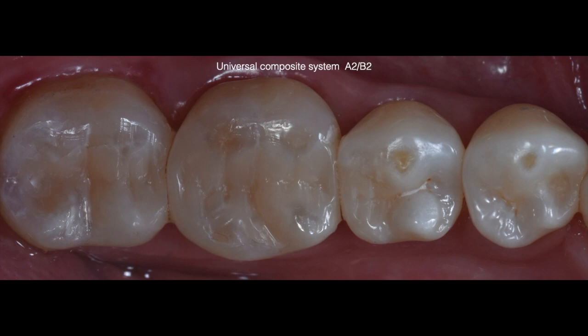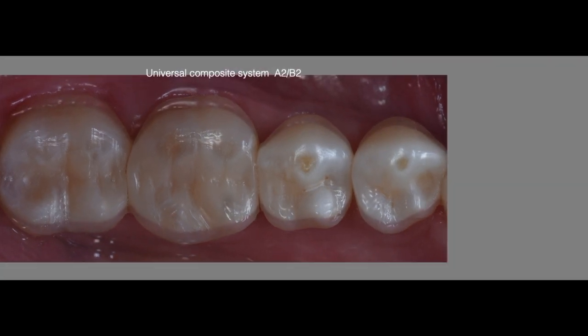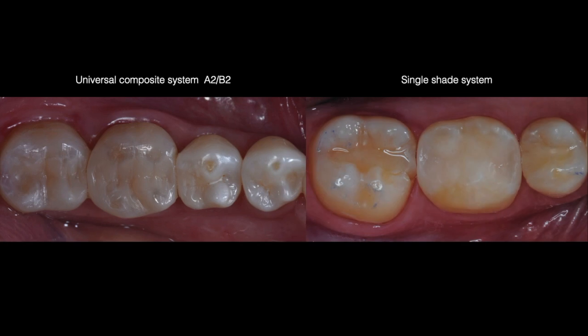This was right after all restorations were completed. As you can see, for the smaller preparations, the restorations were almost imperceptible and a very good match for the larger restorations. Here is a side-by-side comparison of both cases immediately after completion. I do want to mention that my observations and clinical experience with both materials is that the intrinsic opacity of Brilliant EverGlow helps tremendously in regards to mimicking color when there is a lot of tooth structure missing, like in the following case.